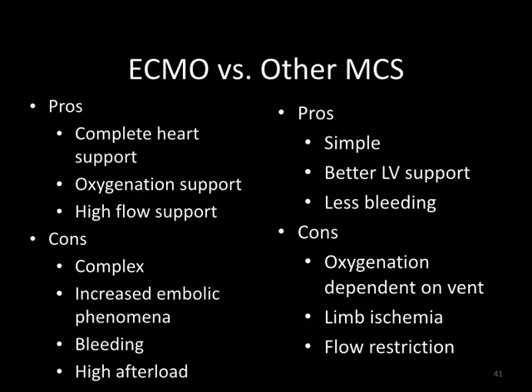So when considering this technology, I think it's important to ask, when should you consider ECMO? What are the pros of ECMO versus the cons of ECMO relative to other left heart mechanical circulatory support devices? In brief, ECMO is complete heart support. Left heart's out, right heart's out, doesn't matter, complete support. It provides oxygenation, and if you have a patient that requires high flows, ECMO can do that for you. But it's very complex. There's increased risk of embolic phenomena because of the oxygenator that's sitting there. There's a high risk of bleeding and high afterload.